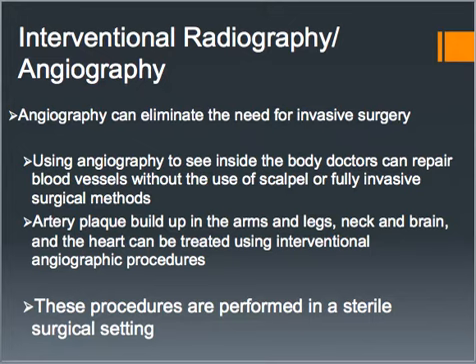So for a minimally invasive study like angiography, you can diagnose and treat or use therapeutic options very minimally invasively by just making a small cut in either the wrist or the groin. And it eliminates that need for invasive surgery, which could possibly mean open heart surgery, where they actually have to crack the chest open. So that's a huge reason why it's so important.